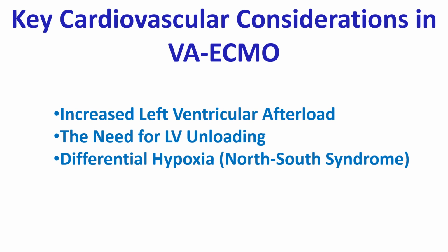Increased left ventricular afterload. The retrograde flow of oxygenated blood from the femoral artery cannula directly competes with the native left ventricle. This increases afterload, which can lead to left ventricular distension, increased wall stress, and pulmonary edema if the LV cannot open the aortic valve.